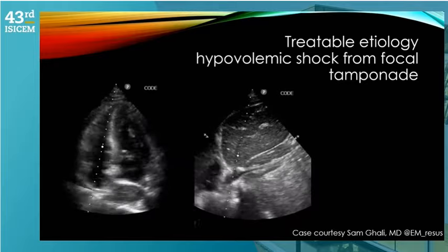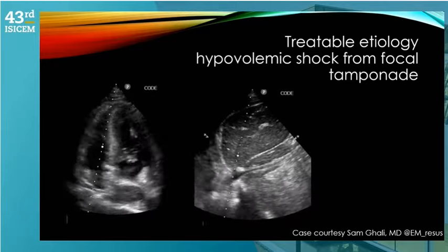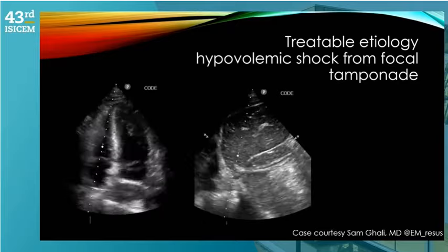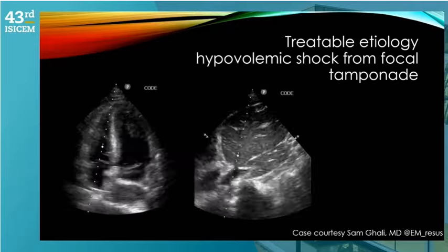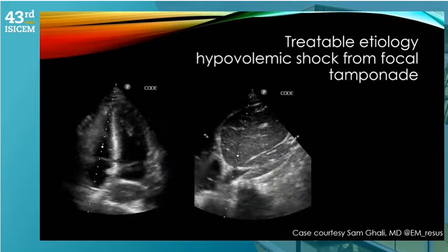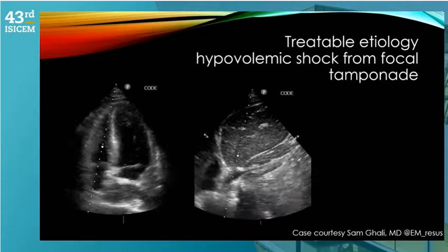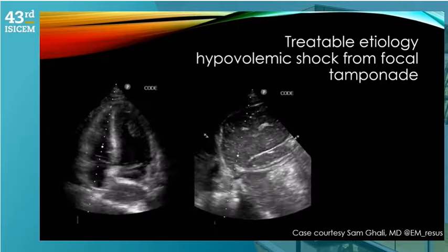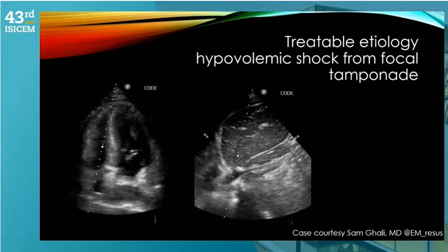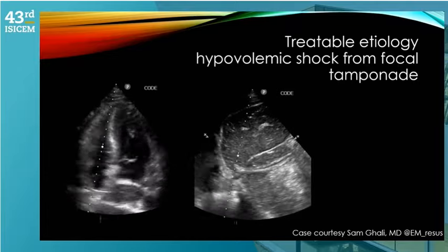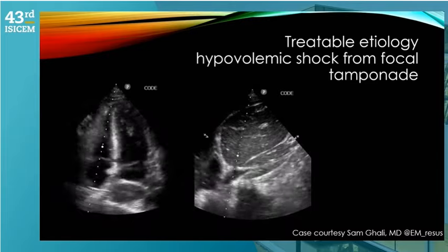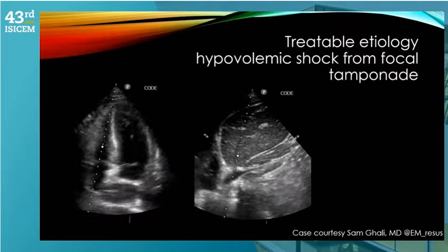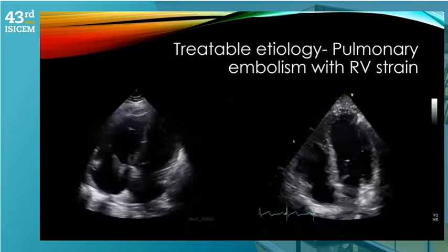The biggest use of ultrasound — if done properly and without delaying CPR — is finding a treatable etiology. In this case, on the right side you can see a collapsed IVC next to the beating heart. On the left side, there is external compression of the left atrium. The left atrium is not getting enough filling, leading to a hypovolemic shock picture, probably from focal tamponade. This is more of a surgical lesion than anything else — a patient that probably needs very emergent directed therapy to treat the cause of shock.